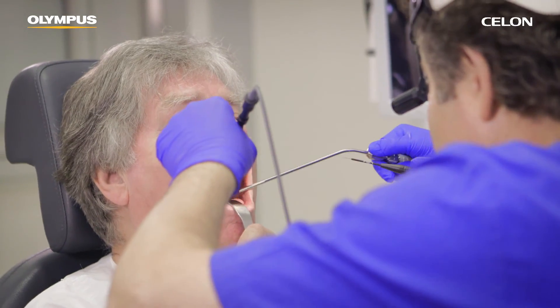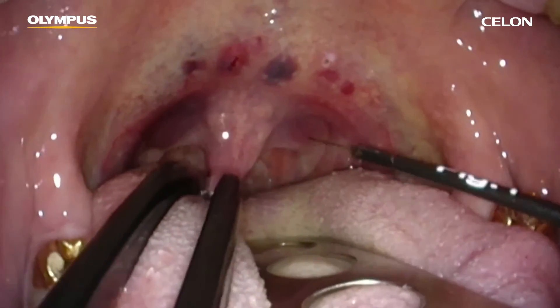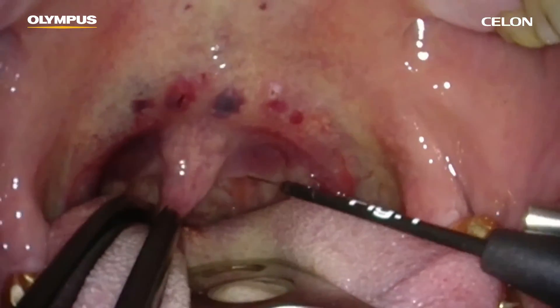For this procedure, a power setting of 20 watts is recommended. The positioning of a neutral electrode on the patient is not required.